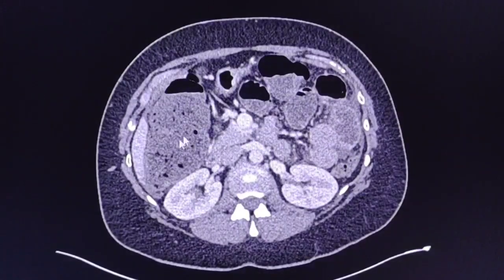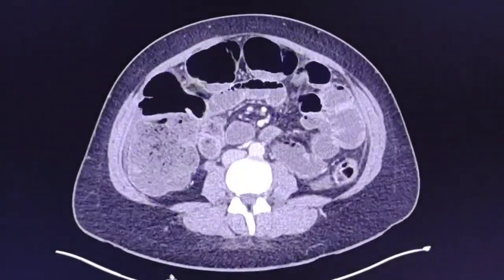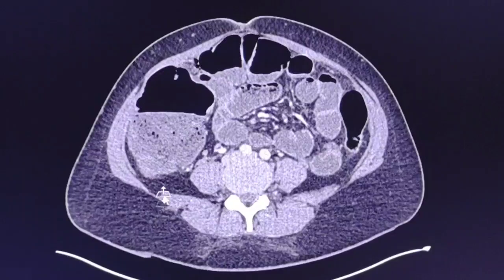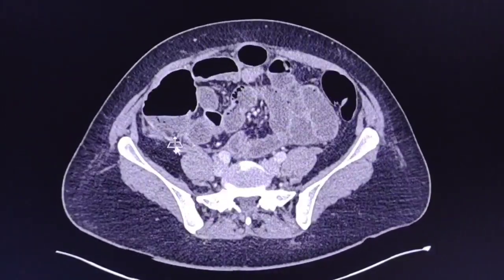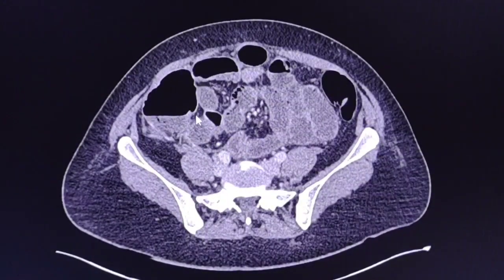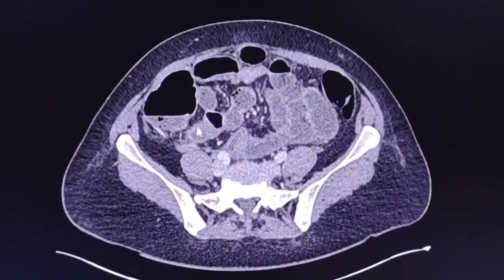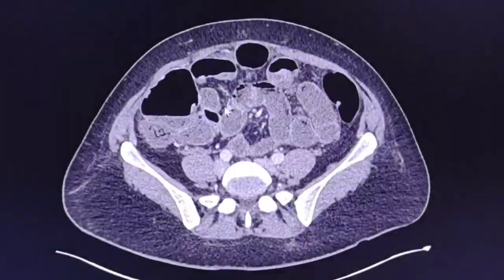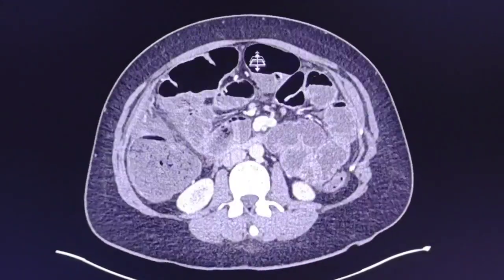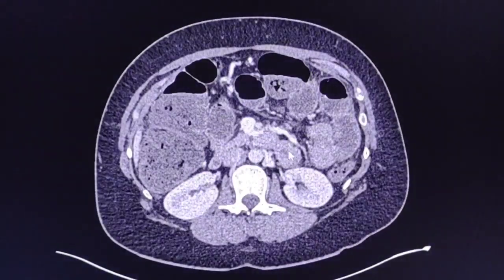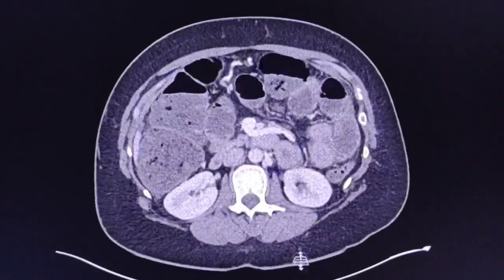There is significant dilatation of the right colon with significant faecal loading. Somewhere here is the ileocecal valve, and the terminal ileum is dilated, as well as there is dilatation of the rest of the small bowel with air fluid levels.